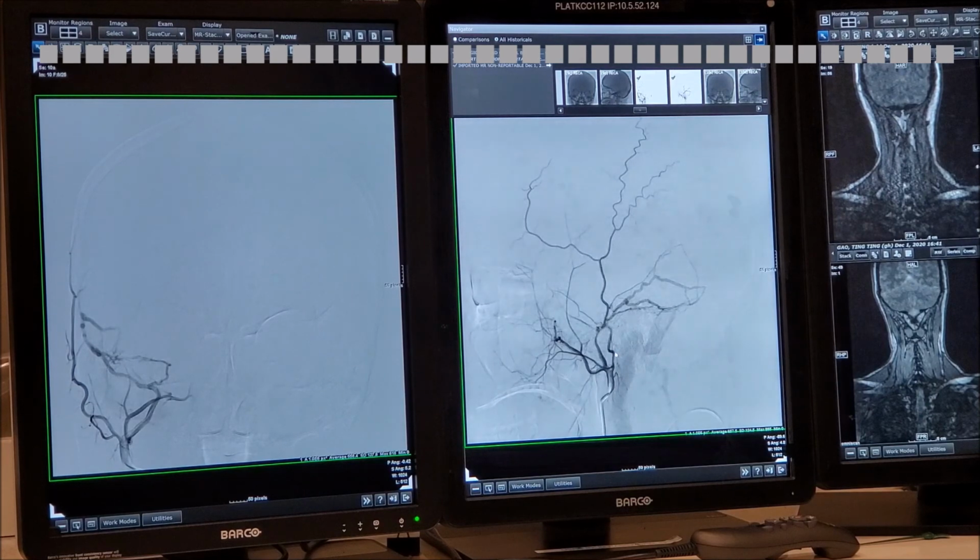What is this artery? Remember we went over this. This curve helps you a lot versus this curve here. Oh, okay. So it should be a branch of the posterior stylomastoid. Well, no. I can't tell. Let's say I can't tell. So instead of going from center to peripheral, go back. What is this? This is a branch of this.